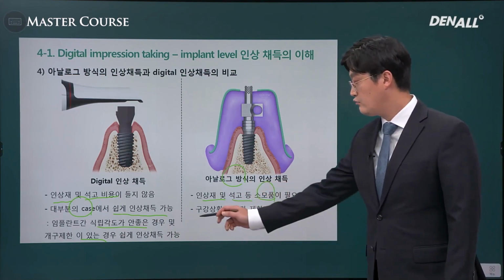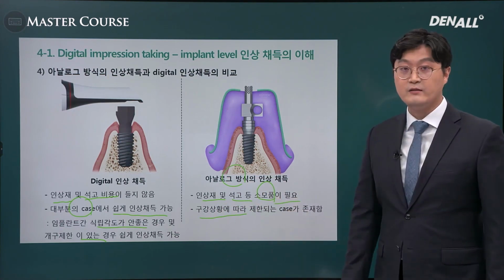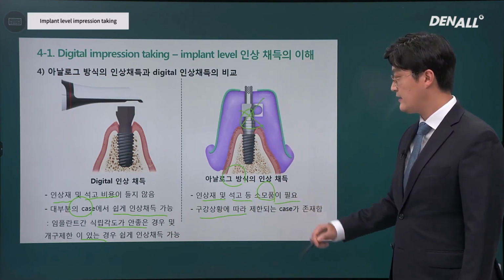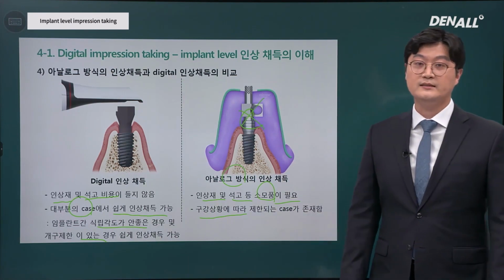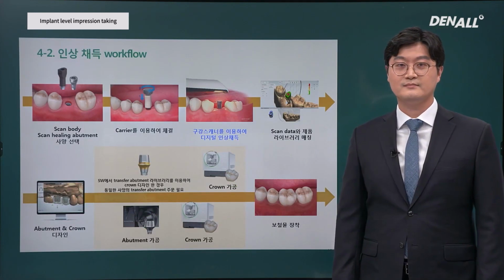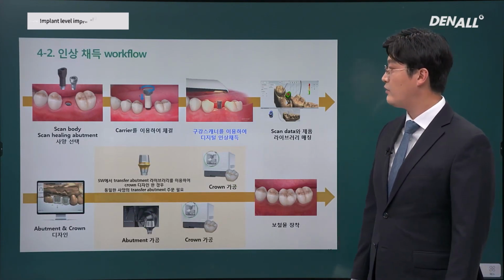They cost money. Depending on the oral situation, for those with mouth opening limitations, a pickup type cannot be used, so it all depends on the specific oral situation.